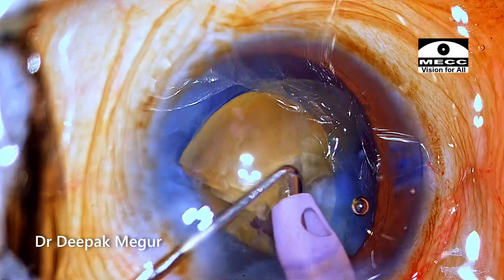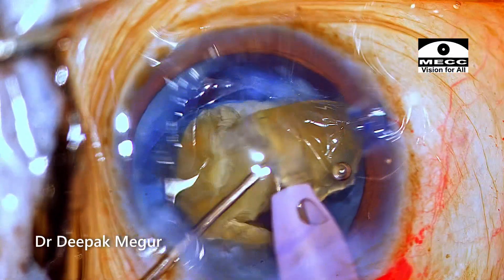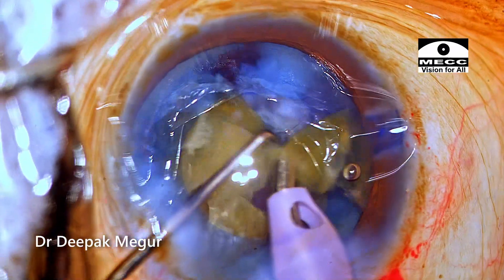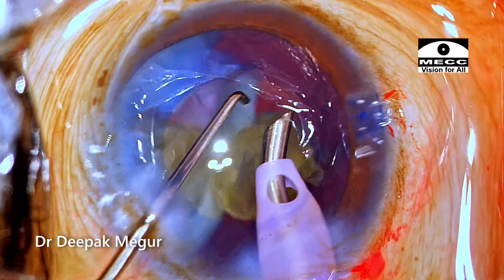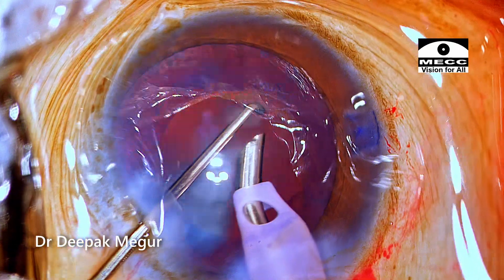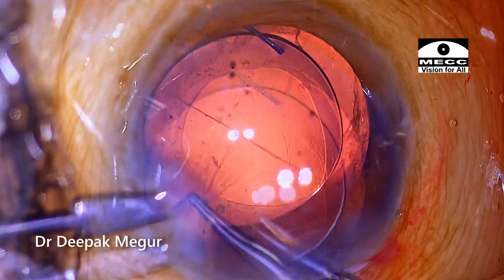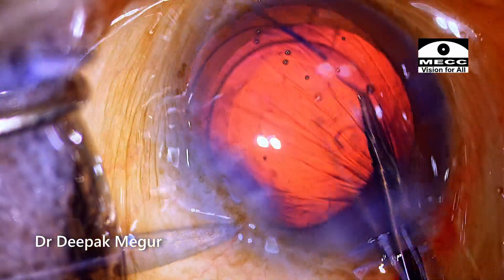Here is a slightly bigger fragment, which I am dividing into two parts and then consuming. I replaced my second instrument with a dialer — initially I was using a sharp-tipped chopper, and this is now a regular Sinsky hook. The purpose of the second instrument is to act as a shield so that the fragments being emulsified don't run away and hit the corneal endothelium. Eventually all fragments are emulsified, the lens is implanted, and the rhexis is enlarged using the same principles of giving a tangential cut, holding the flap with forceps, and then enlarging the rhexis.